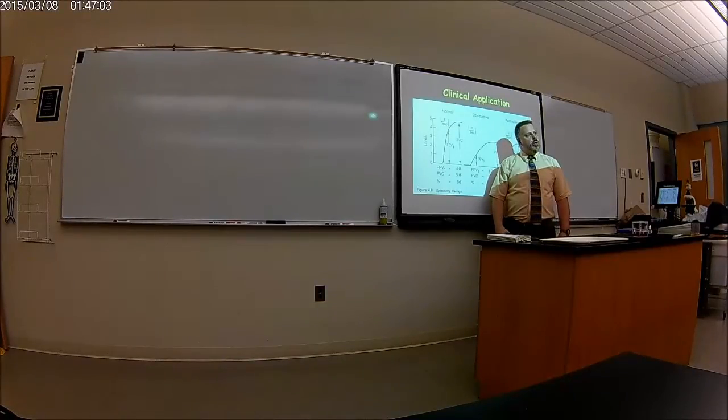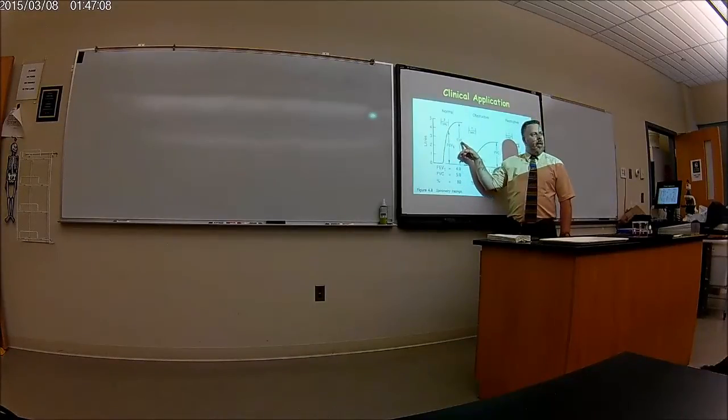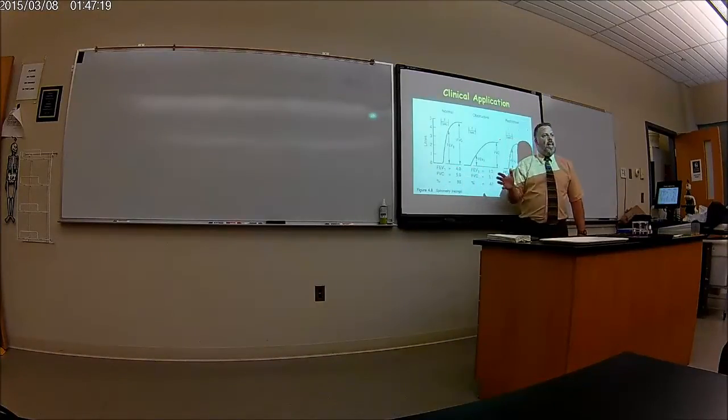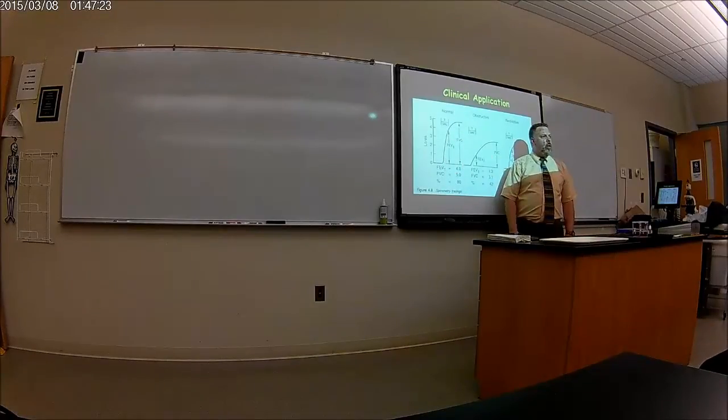Okay? So now you just do the index. 4, the FEV1, divided by FVC. So what's the percentage? 4 divided by 5 is 80. So in that case, 80 is normal. So that's what a normal curve would be. Okay? Your magic number would be 80. That's a good number. Okay? Anything more than that will be restrictive. Anything less than that will be obstructive.